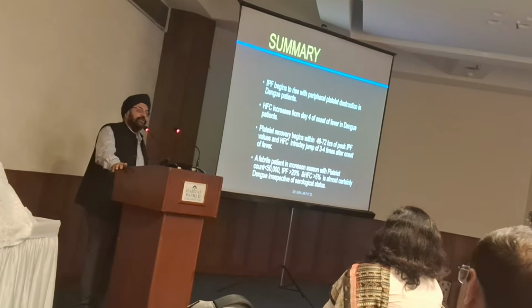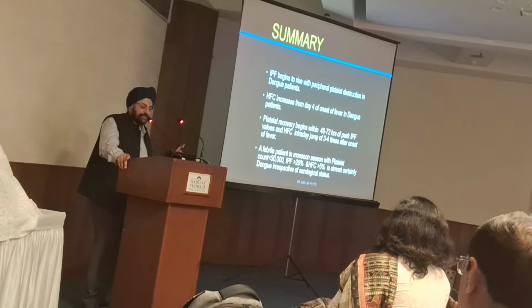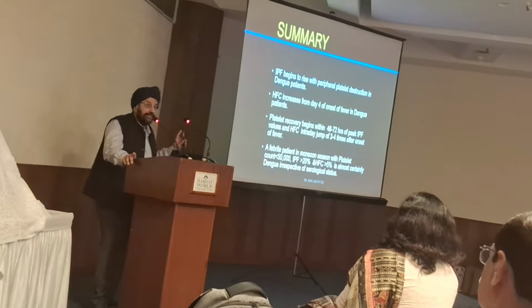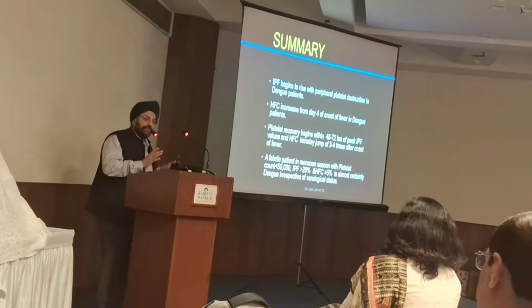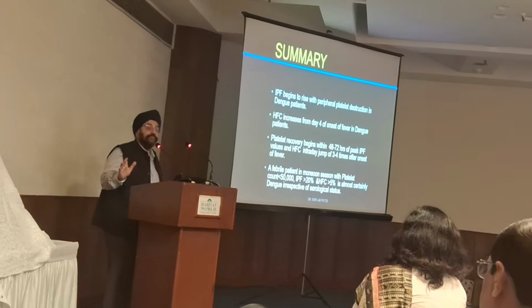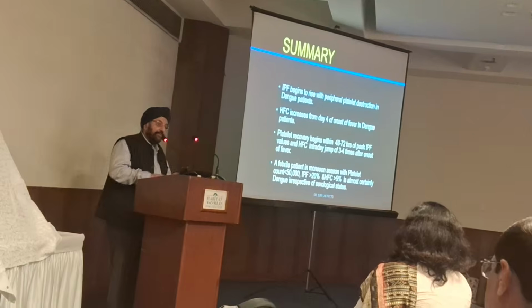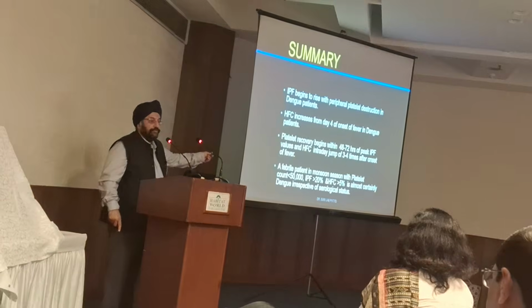A febrile patient in monsoon season with platelet count less than 50,000, IPF more than 20%, and HFC more than 5% total is almost certainly dengue, irrespective of the serological status. I am saying irrespective of the serological status because NS1 antigen usually remains positive for the first 4 to 5 days. Even on the 5th day, sensitivity falls from 95% to about 65%. And the antibodies sometimes don't come by day 7 to day 8. So that period between day 5 to day 7 is the window where both your antigen and your antibodies could be negative. But this CBC is going to give it away for you.